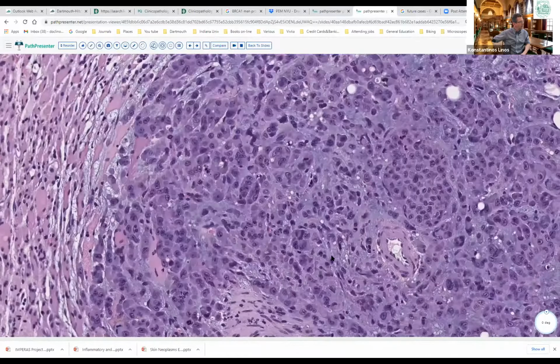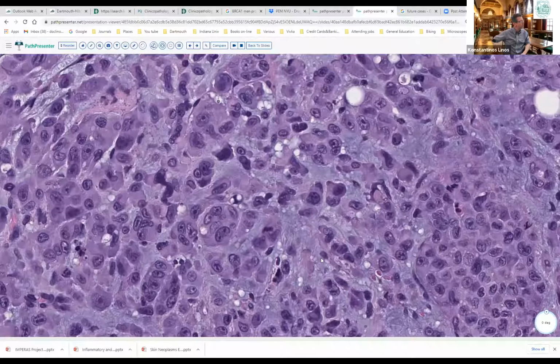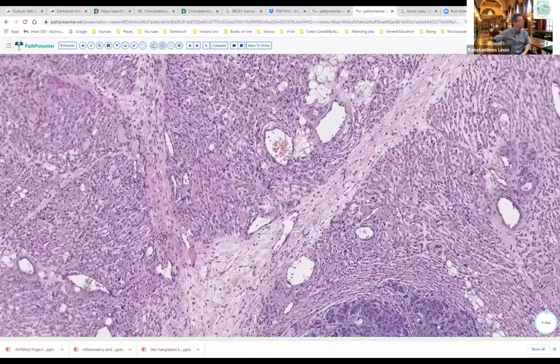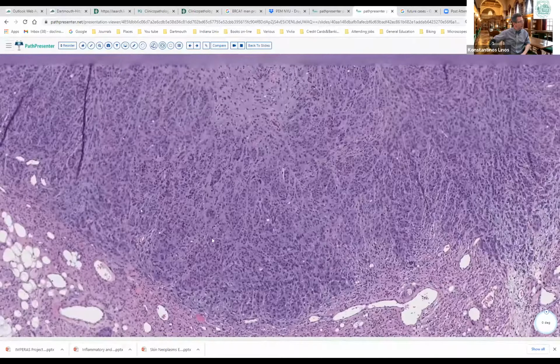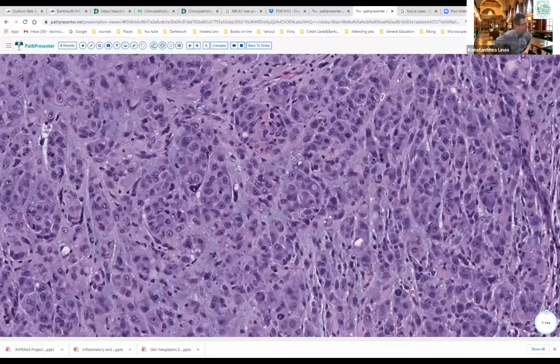There are some vacuoles, maybe, or glands. And I'll stop here, and we can discuss what you will do, or what your thoughts are, or I can go all the way through. You tell me what you want to do.